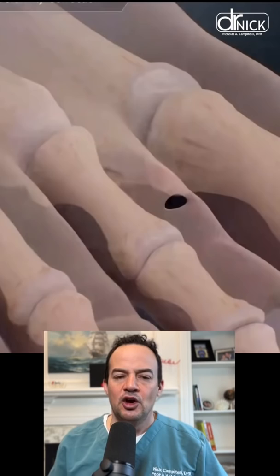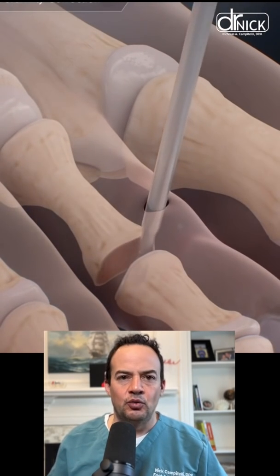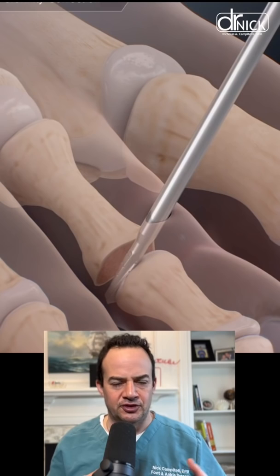We're making tiny stab incisions. We go into the toe joint and use a burr to remove the cartilage. We then remove it from both ends of the articular surface.